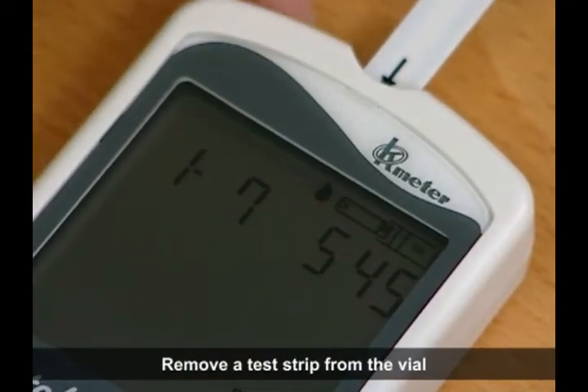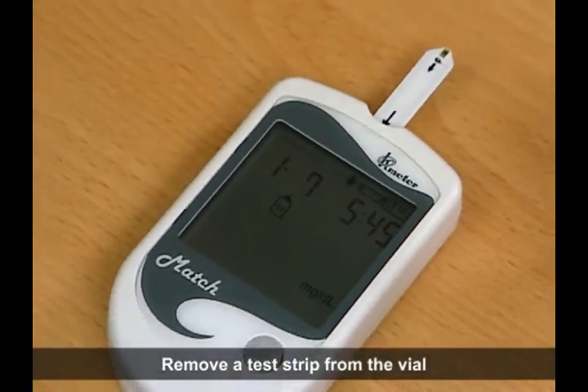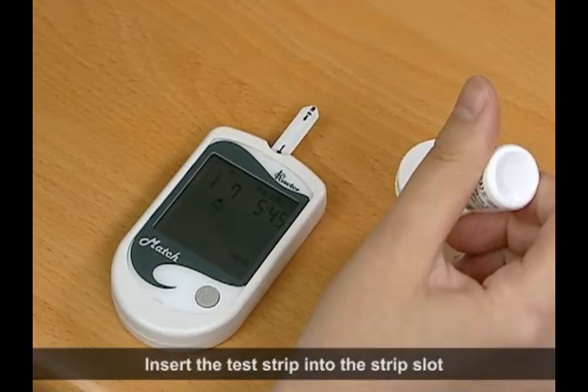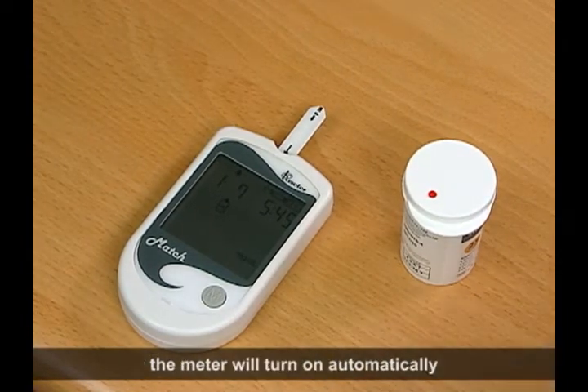Remove a test strip from the vial. Insert the test strip into the strip slot. The meter will turn on automatically.